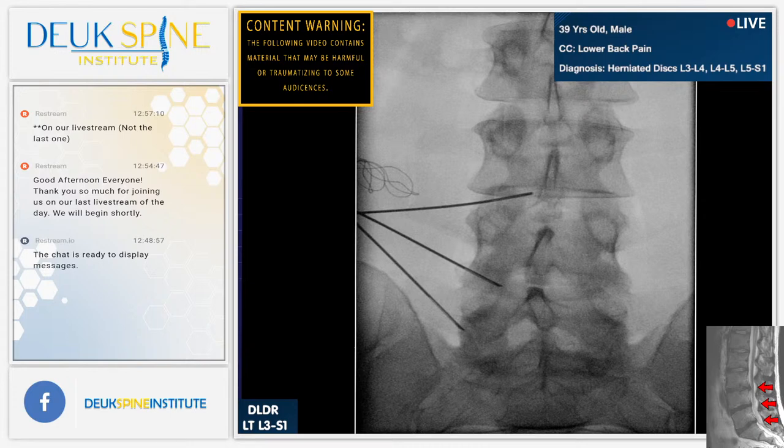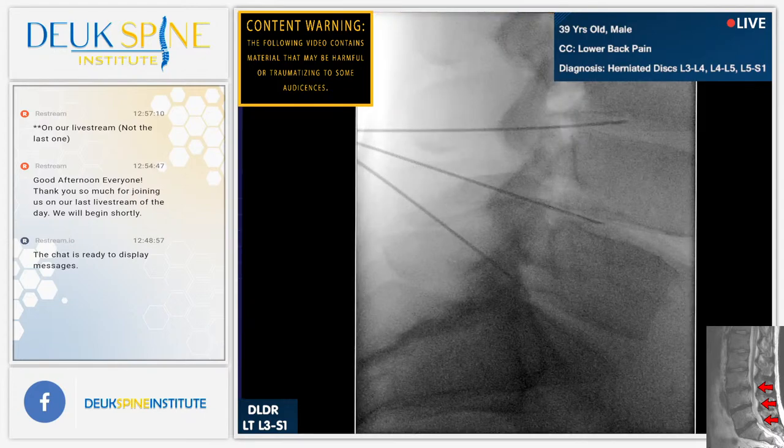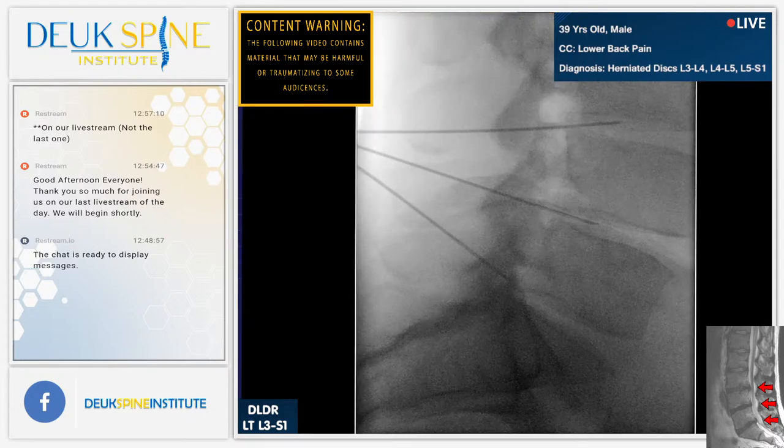All right, back down to a lateral 5-1. So we are in position at 3-4. 4-5 looks pretty good. And the only one I'm waiting on is L5-S1, the hardest one to do. We want our patient to be a little bit more awake. So I'm gonna wait another minute.